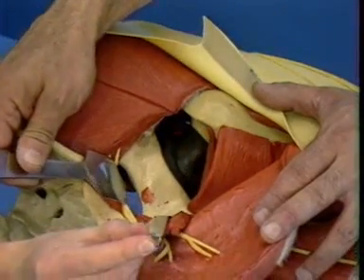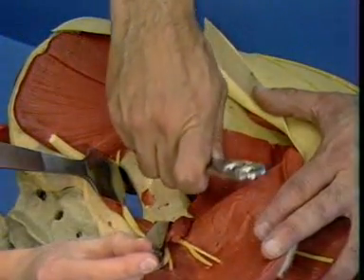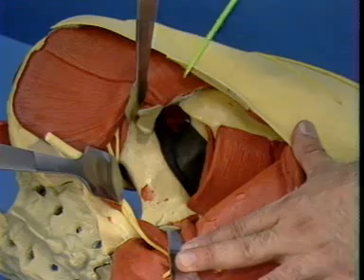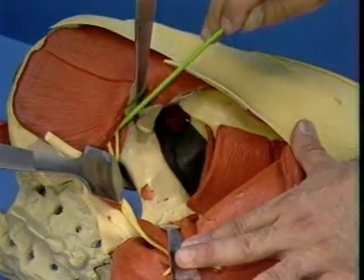A second retractor can be placed into the greater sciatic notch, retracting the piriformis muscle. A Hohmann retractor can be placed with the tip driven into the inferior iliac wing. Care should be taken not to stretch the superior gluteal nerve.